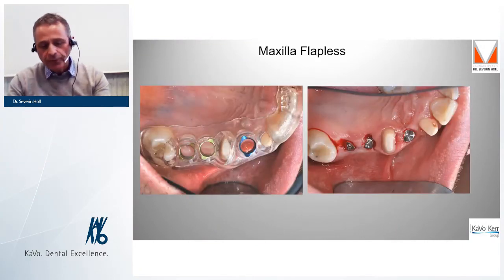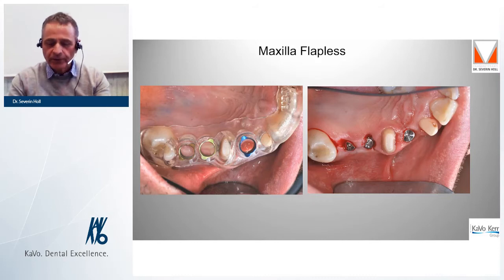To prevent you from thinking that we are only showing simulated cases, here are the clinical pictures of the patient. The patient came from Italy only for a short stay to have the implant surgery done at our practice. That is why we performed this surgery flapless. On the left side you can see the surgical template in place, and on the right side the surgery result.